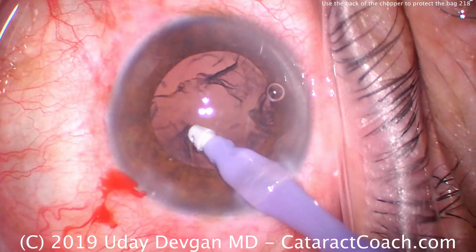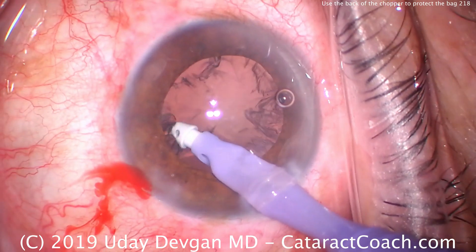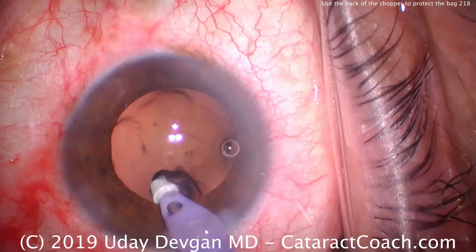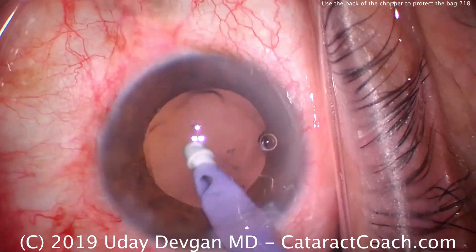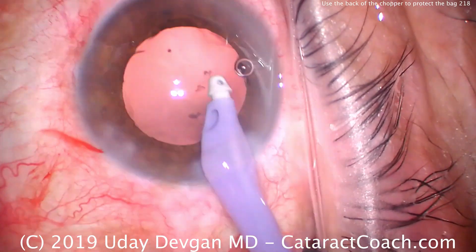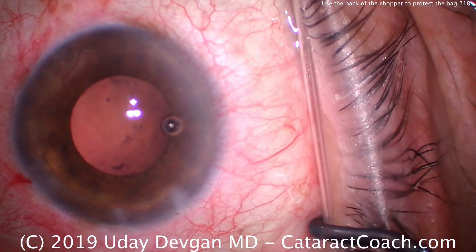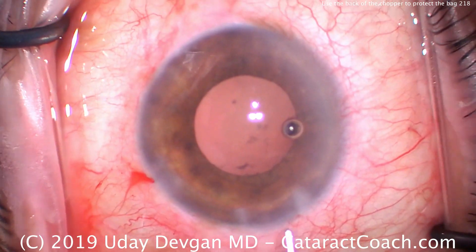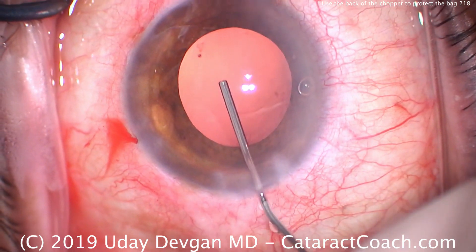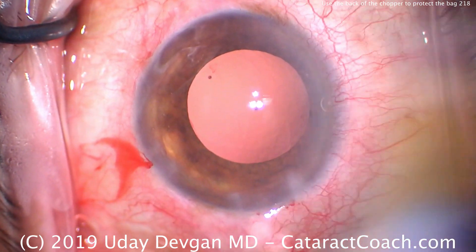With cortex removal, we have a few things to our advantage. Number one, the tip is a polymer or plastic, so there's no metal tip to touch the posterior capsule. Another thing is that the aspiration port on the IA probe is very small, whereas the infusion is the same size as the side ports compared to phaco. So the fluidics are not balanced — during IA there's a lot more inflow of fluid and a lot less outflow, whereas during phaco there's a lot more outflow, so it doesn't balance quite as well.